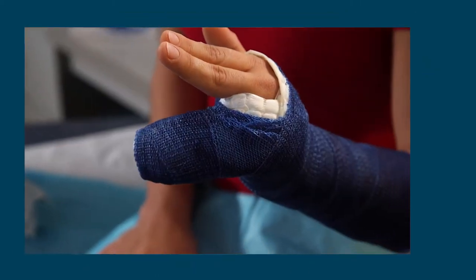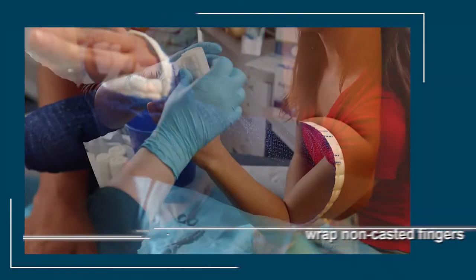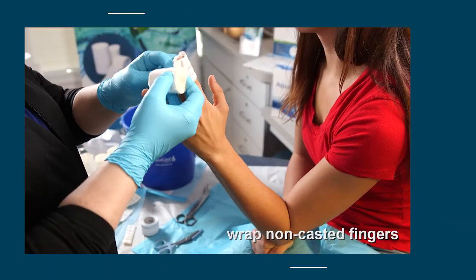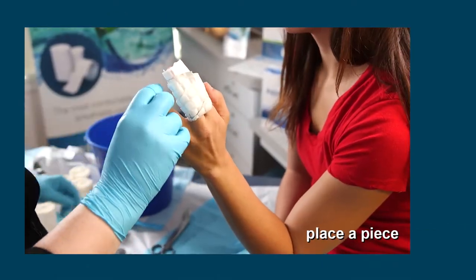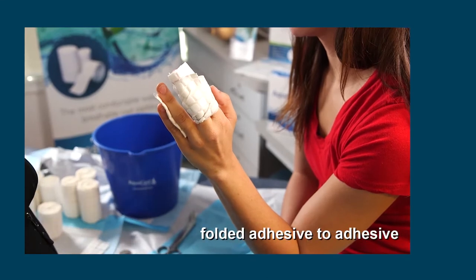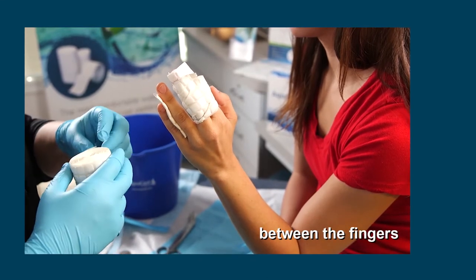To keep the non-casted fingers out of the way, wrap them with AquaCast Liner or other protective material. Place a piece four pads long, folded adhesive to adhesive, between the fingers.